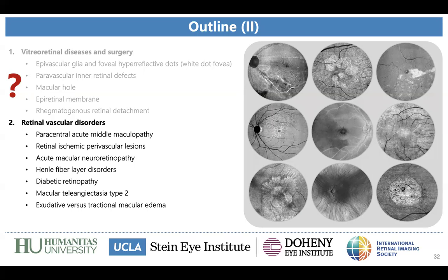Thank you. Well, Alessandro, we are always trying to make it practical for the ophthalmologist, so that tomorrow, the next time he sees a patient, he can apply it in the practice. So if you have any insights that might not be in your presentation, any clues or ways to make it easier to take care of patients, feel free to acknowledge it.